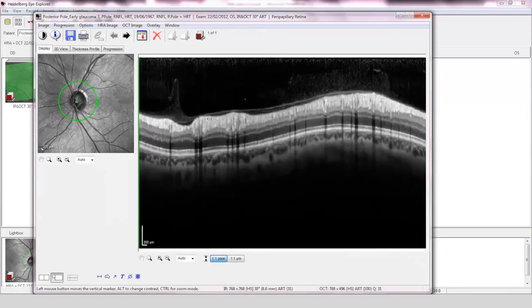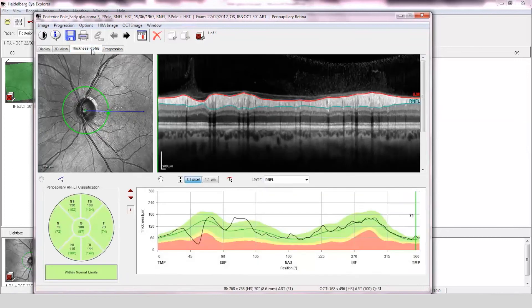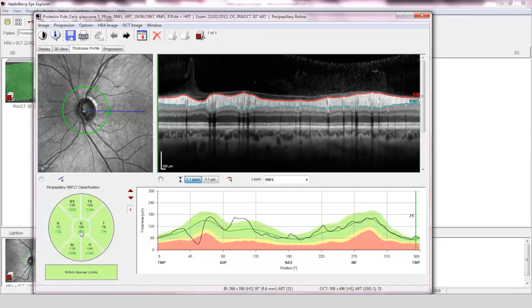Retinal nerve fiber layer assessment. The OCT scan quality is good with a clearly stratified structure and the scan is centered on the optic disc. The fovea-to-disc alignment is correct and the retinal nerve fiber layer has been accurately segmented on the OCT scan. Comparison to the normative database is within normal limits, although the temporal superior quadrant does show some slight thinning.